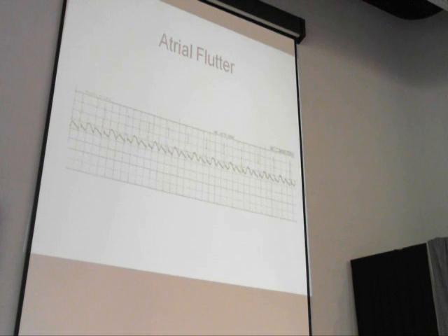Because those are all abnormal P waves, flutter waves. Remember what we said they look like? Sawtooth, picket fence, shark's teeth. With atrial flutter you have more than one P for the QRS.